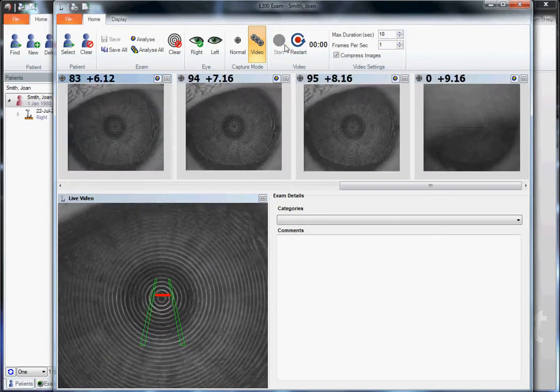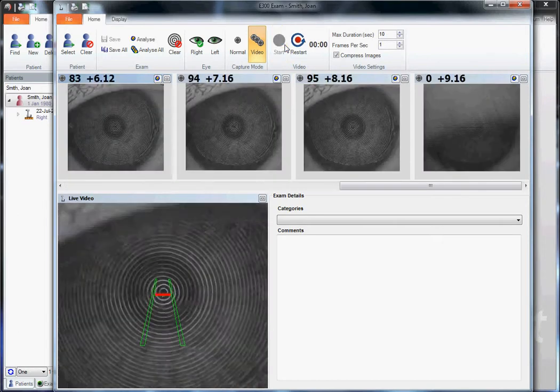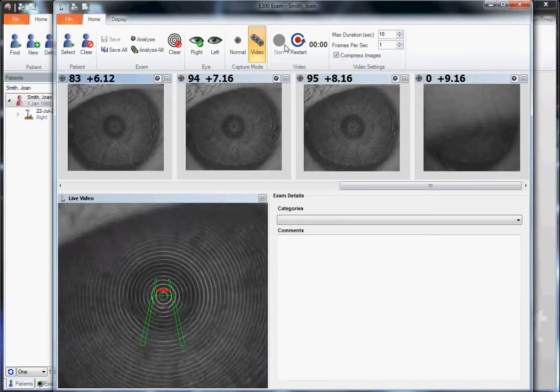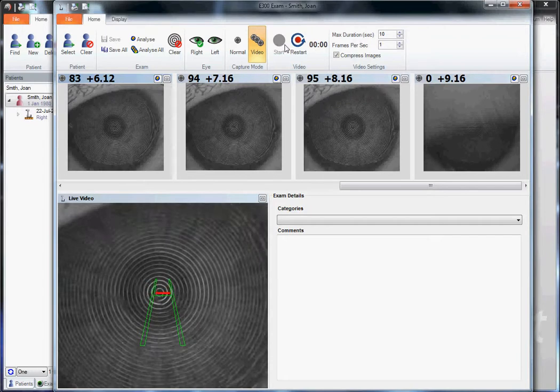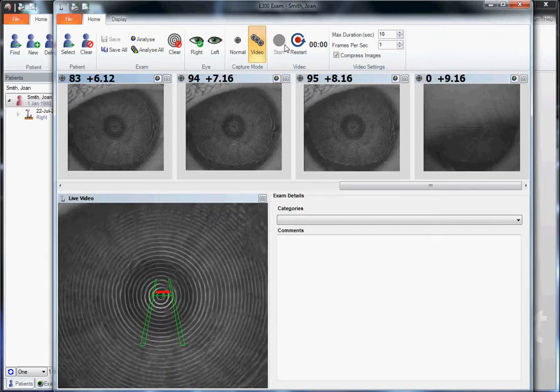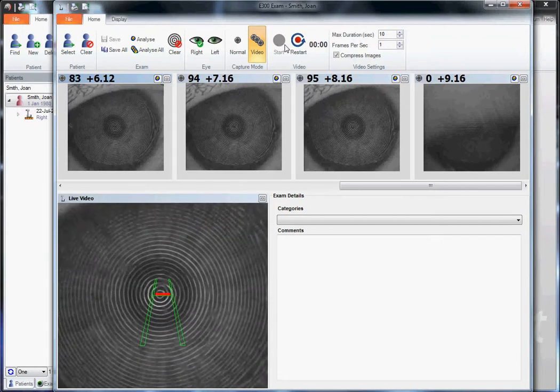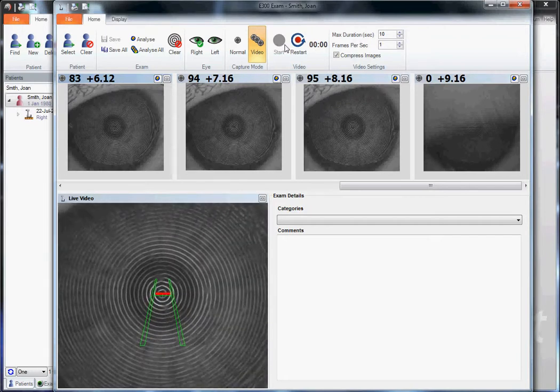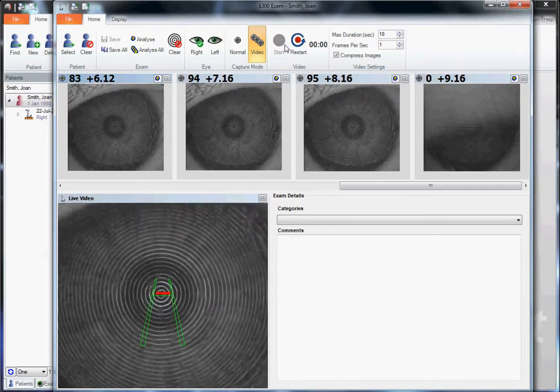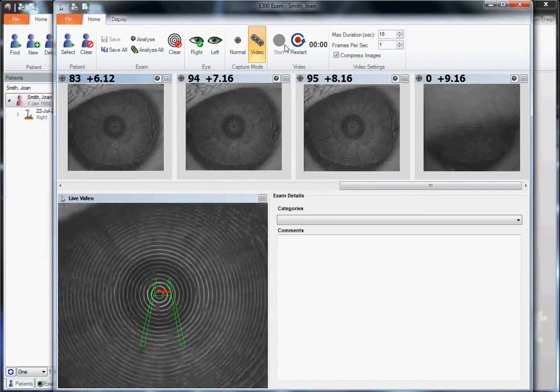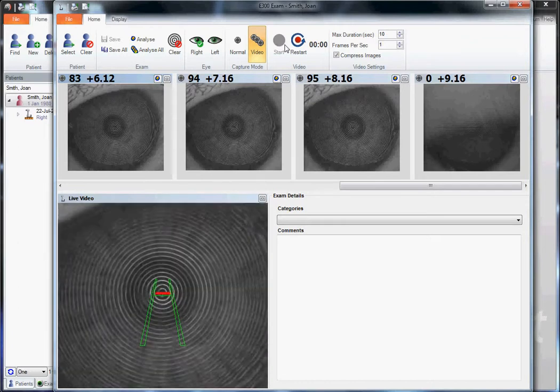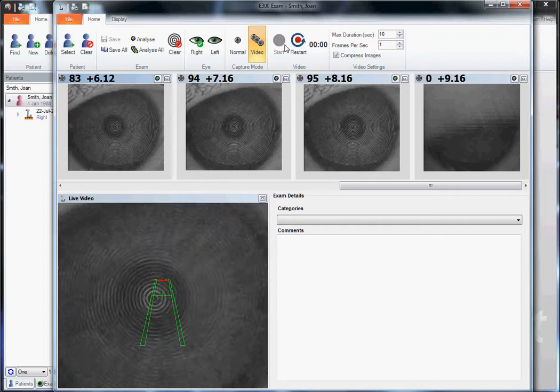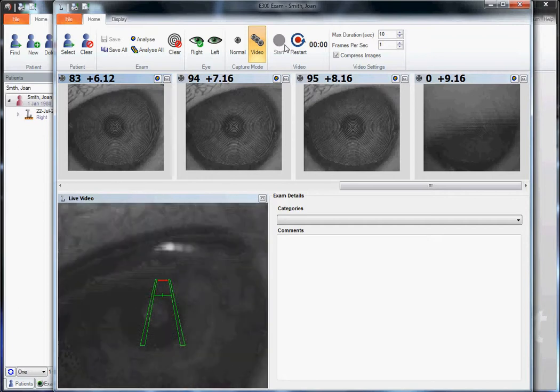Looking at the Placido you can see this patient's dry eye condition. There's plenty of distortion in the Placido reflection indicating the breakup of the tear film. Now the instrument has already taken its 10 seconds of capture.